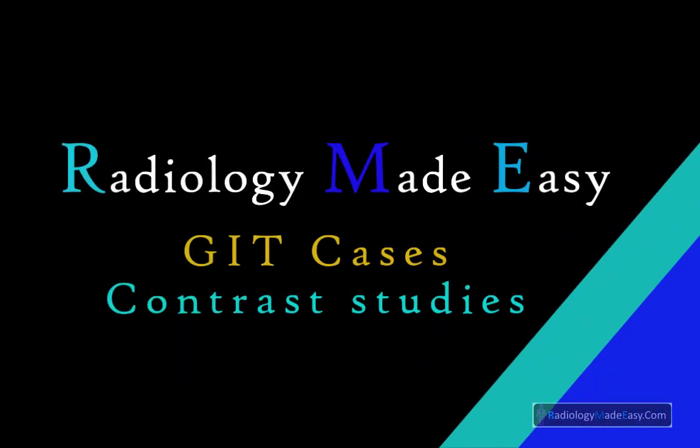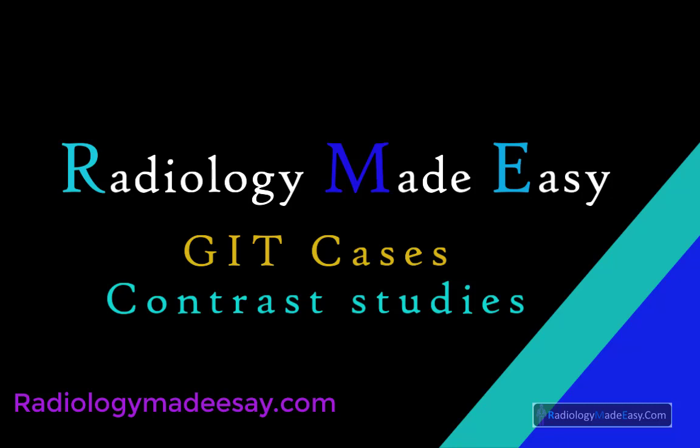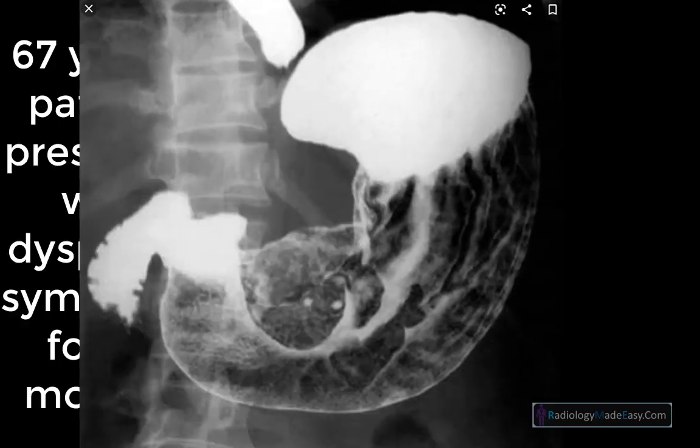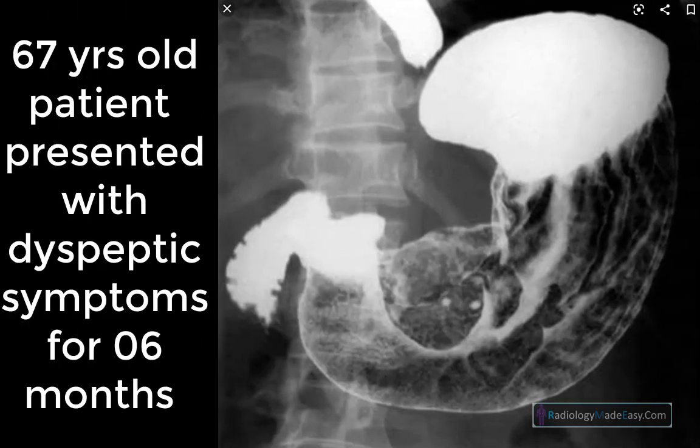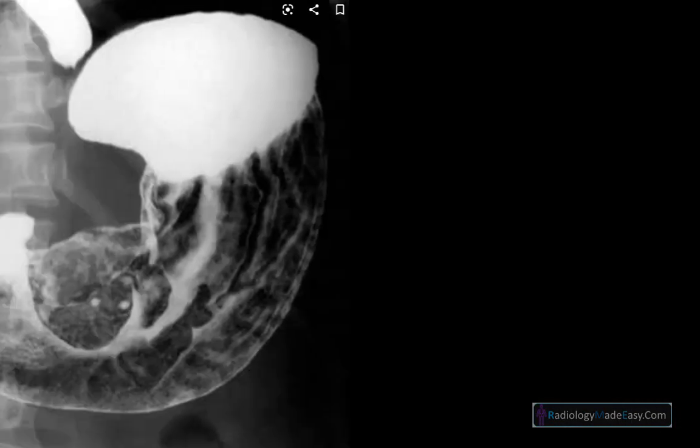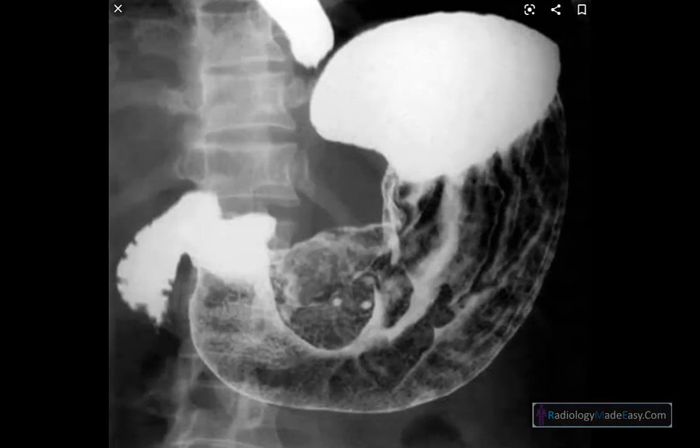Hello everyone, welcome back to Radiology Made Easy, your all-time favorite YouTube channel. Let's see today's case. This is the image of today's case. First go through it and come to your own diagnosis, then we will continue with the case discussion.